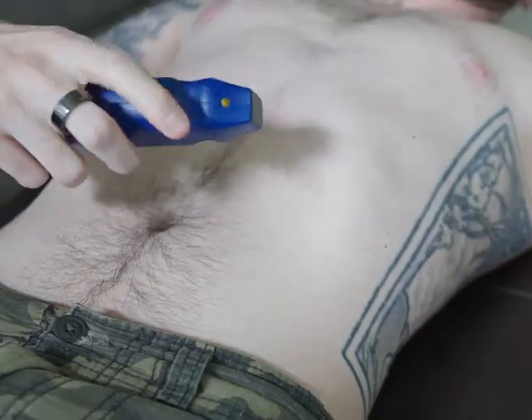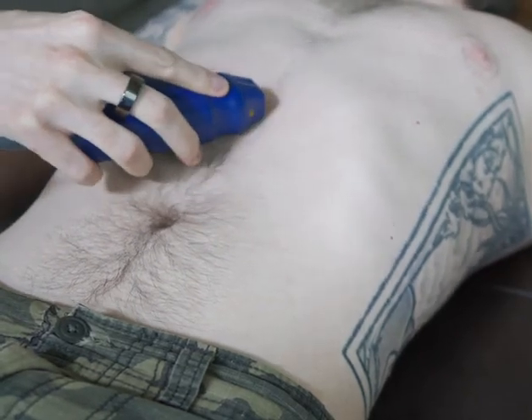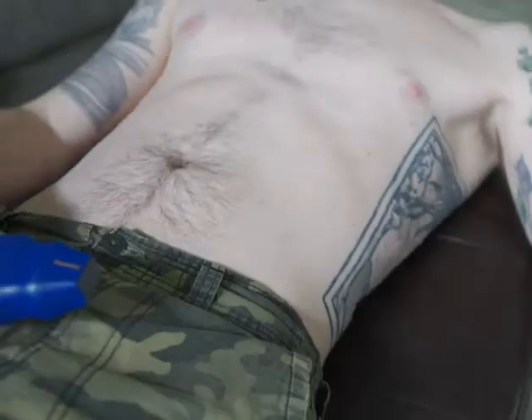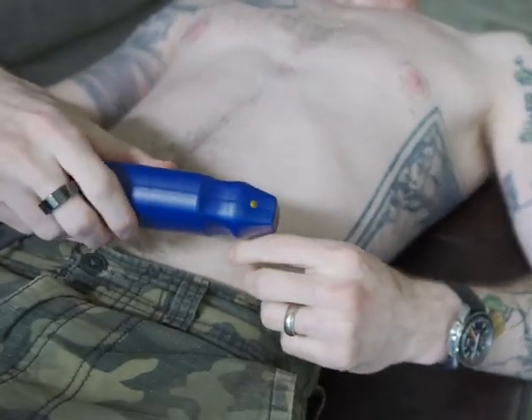If using the standard echo convention with the probe marker on the right side of the screen, then your physical probe marker should be oriented towards the patient's left side. But if using EM convention, the probe marker will be oriented towards the patient's right side.